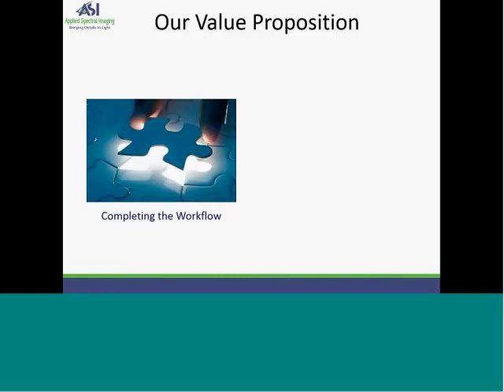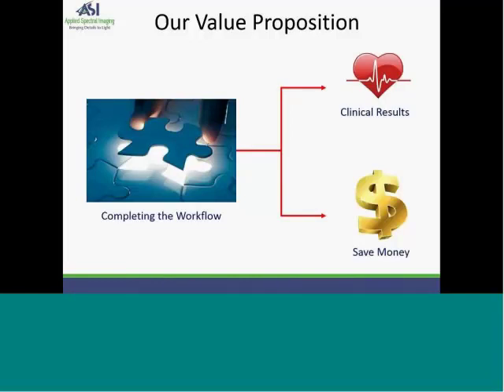So our value proposition is to have a complete digital workflow which bridges H&E and FISH analysis. We believe TissueMatch will make FISH faster and more efficient, and by providing more confidence and clinically relevant data to the pathologist, we will help improve the reliability of the clinical results. And the end result of having a process which runs correctly will be higher quality results, reduced time per slide, manageable records, and lab savings.